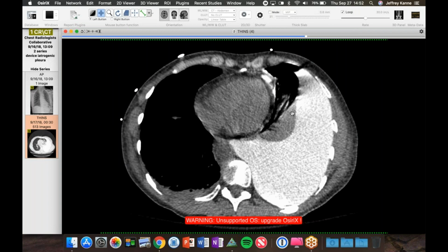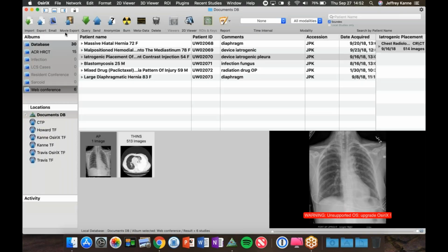But that's like 2 liters of fluid, though. It's a lot. Were they giving him other fluid too? Because I guess historically this was originally called a glucothorax. Yeah, I don't know. I agree with you. All I know is they put in a drain at the outside institution and sent the patient to us to deal with this issue and some other things going on. But just one of those things you don't see every day, a nice example of a malpositioned line or line misadventure.